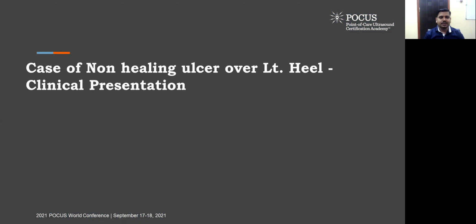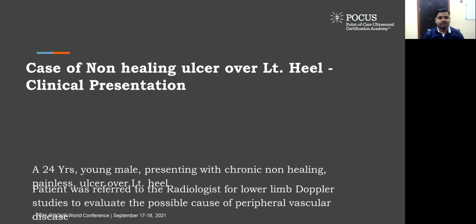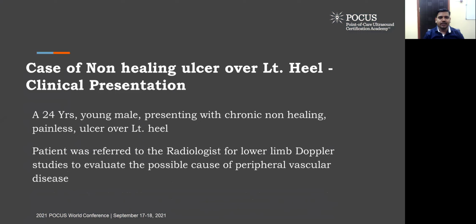So here comes the clinical case presentation. This is a 24-year-old young male presenting with a chronic non-healing ulcer, which is painless and present on the left heel. The patient was referred to the radiologist for lower limb Doppler studies to evaluate the possible cause of peripheral vascular disease.